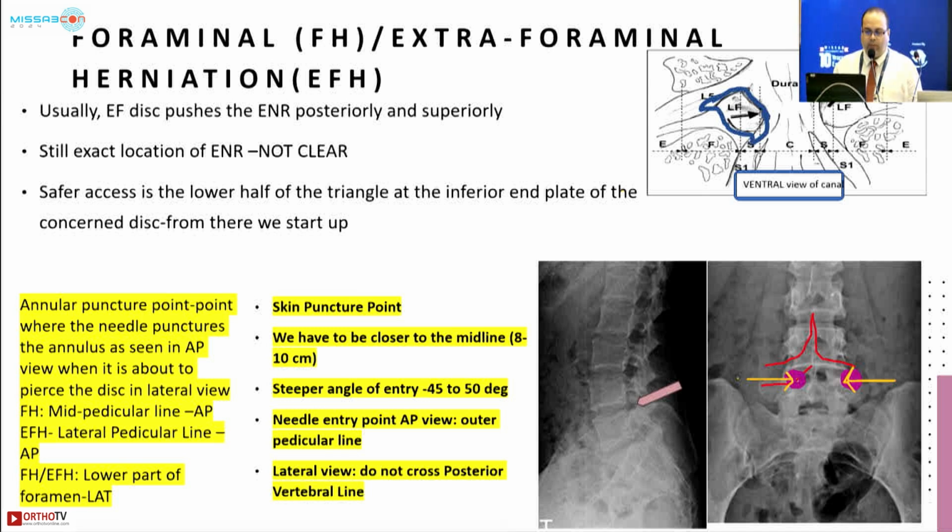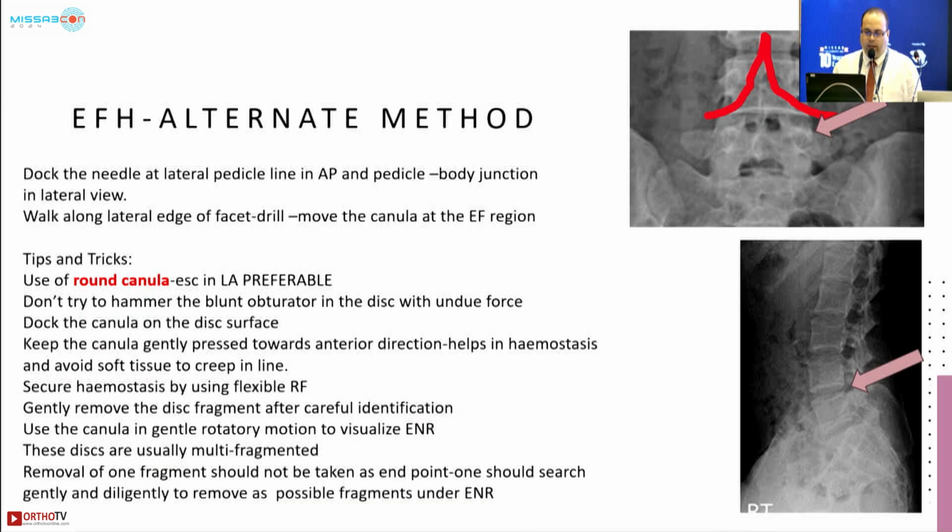If you see the skin puncture point, then we should be much closer to the midline, just like the higher level discs L2-3 and L1-L2, and we should have a steeper angle of entry of around 45 to 50 degrees.